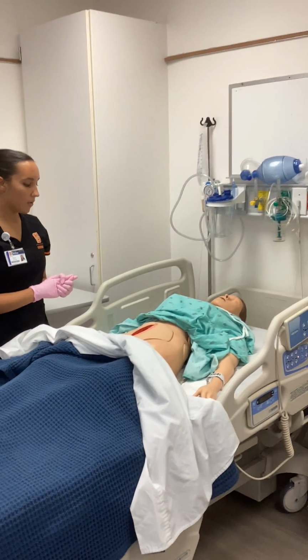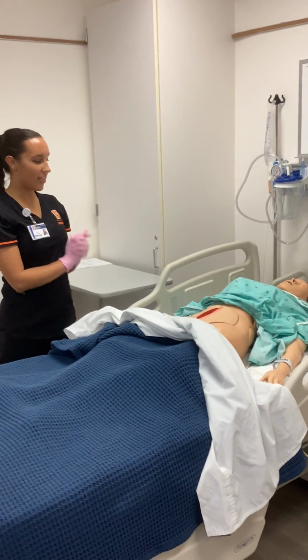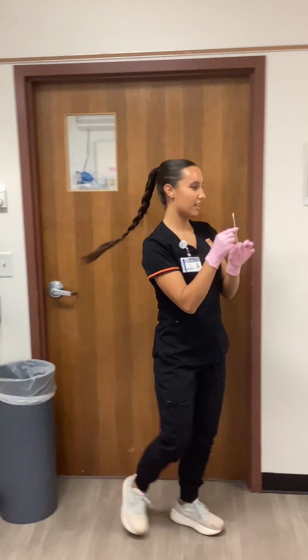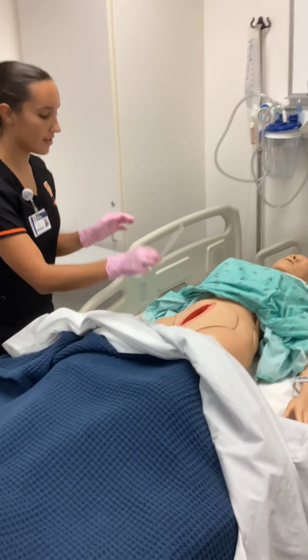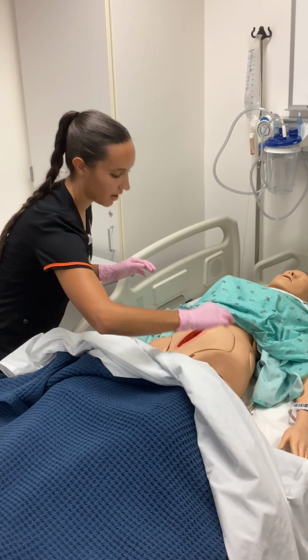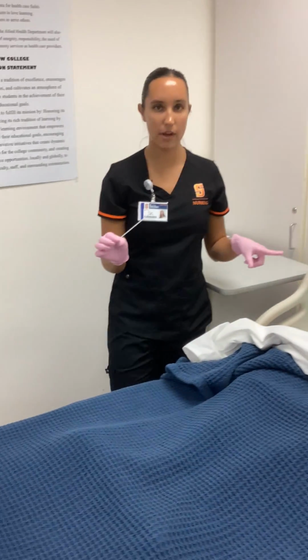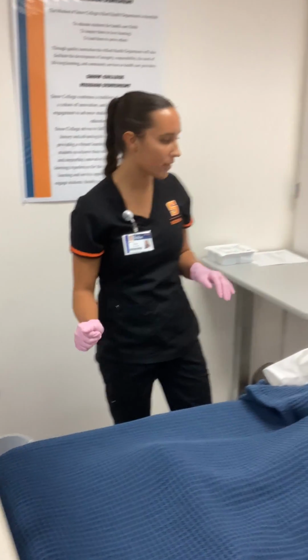And so now we are just going to measure the wound. I'm going to come over here and grab a sterile measuring stick, and I am going to measure the length, and then I would measure the width, and I would measure the depth. Okay, and I would document that so we can keep an eye on the incision, and I'm going to throw that away.